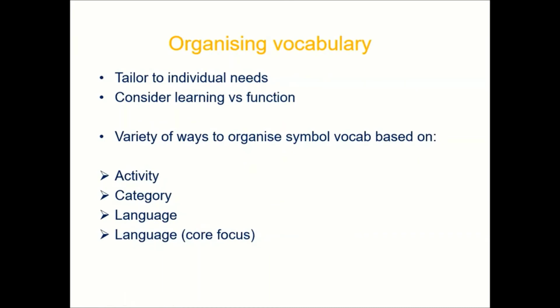So once you've selected some appropriate vocabulary for your client, you need to think about how you're going to organize it and lay it out on a chart or in a book. And as with most things in AAC, there is no right and wrong. It's just what fits for your client and what's functional.